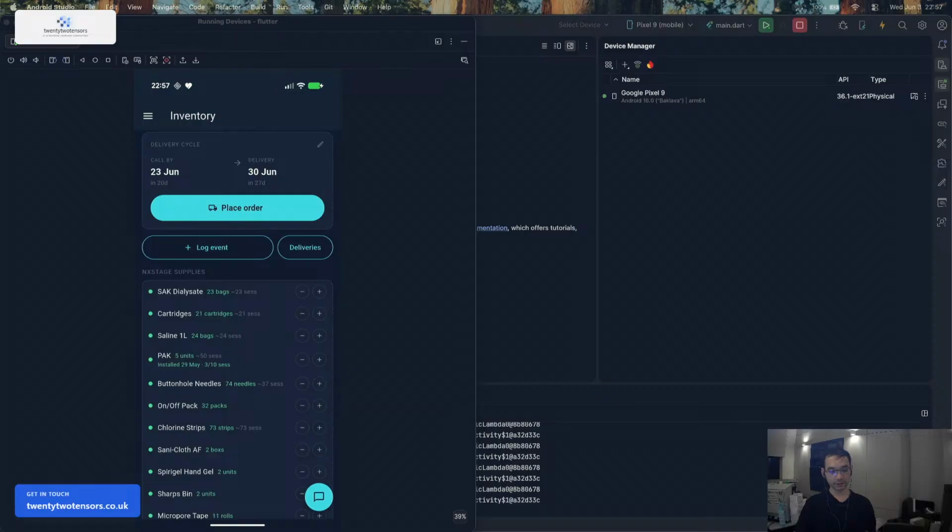And the next section is about fitness. What I want to do is have everyday monitoring.